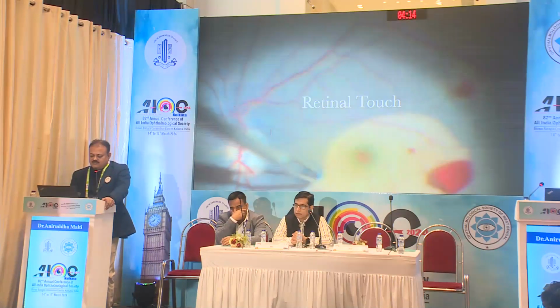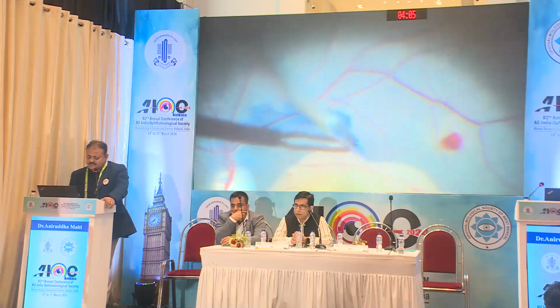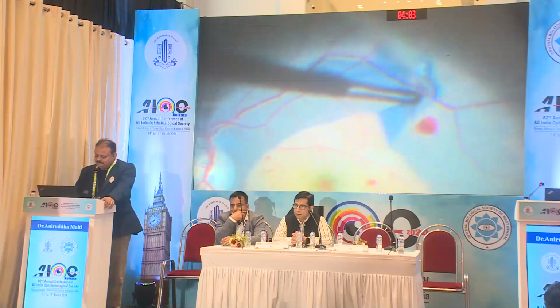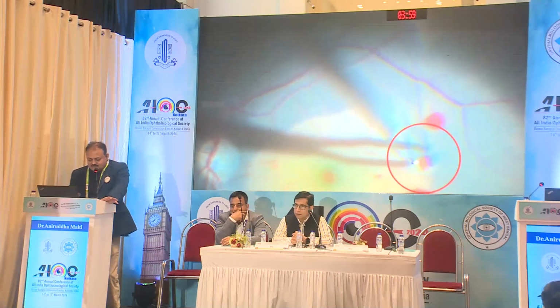cases, how to prevent a retinal touch. Generally, it is not that common, but it can happen if you are a little bit close to the retina. As in this case, almost the case was over. In the last bit, it touched the retina, and the break was a little bit big.